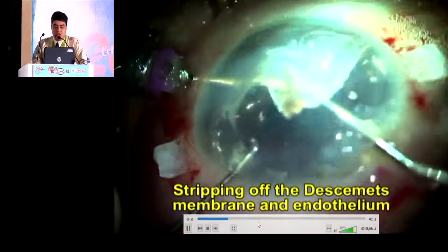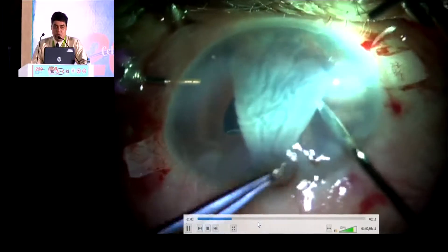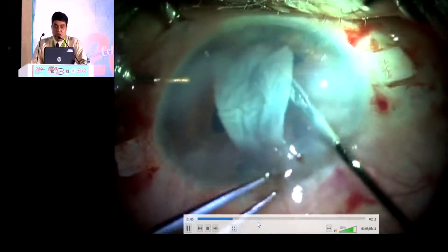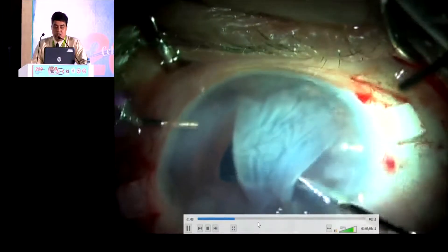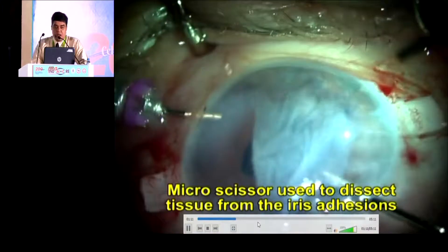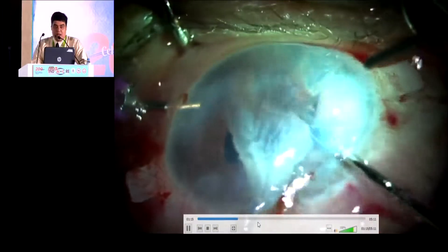Then using a blunt instrument, we are trying to strip the Descemet membrane along with the endothelium. As we are trying to remove that, we see there are a lot of adhesions of the scar tissue into the iris, and gently trying to separate and with the help of micro-scissors, cutting the iris adhesions.